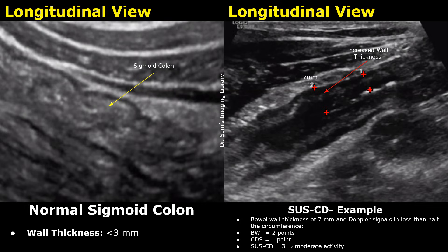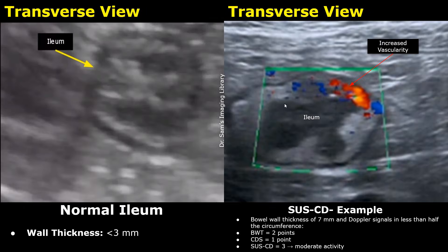Now let's look at an example using the SUSCD system. This is the sigmoid colon in the longitudinal plane with a bowel wall thickness of 7 mm. Since this is between 5 and 7 mm, it is given 2 points. For the ileum in this scenario, the color Doppler signals are seen in less than half the circumference, giving a CDS score of 1. Adding 2 points for bowel wall thickness and 1 point for color Doppler signal gives a total score of 3, indicating moderate disease activity.